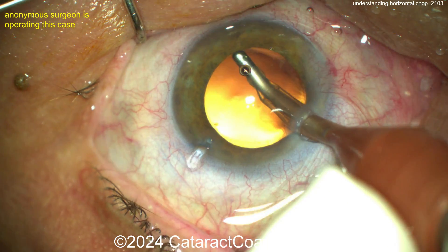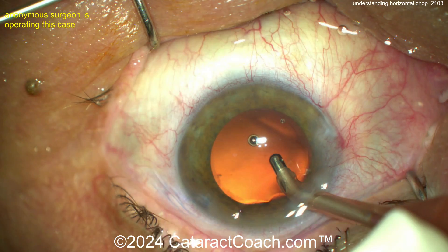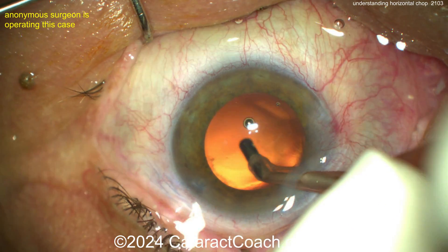End of the case — cleaning up the capsular bag. That looks really nice. Get the lens in and call it a day. Beautifully done case here, anonymous surgeon. So again, horizontal chop — now you understand it.